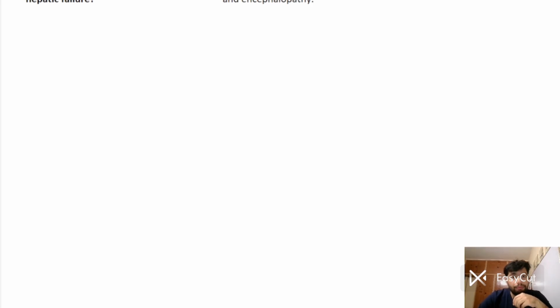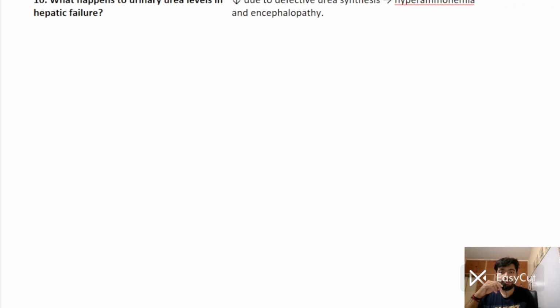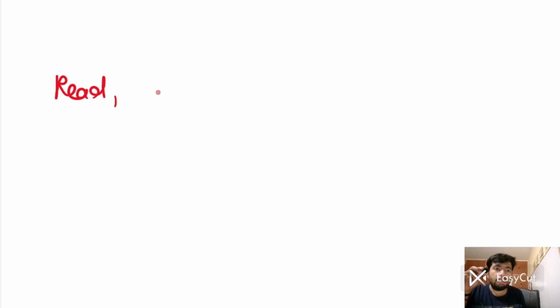Okay, so here we conclude our practical. This is a very long practical actually, but I have covered almost all the points that should be important in your viva. Beyond that, no one is going to ask you at this level. So you will read it, revise, and if you have any doubts you can contact me directly also.